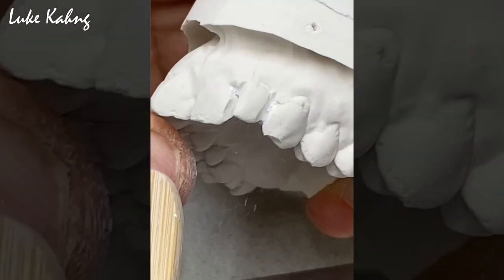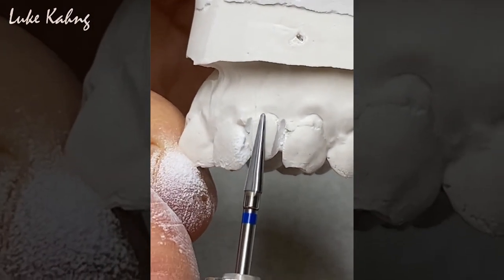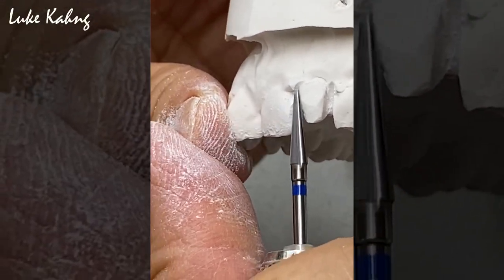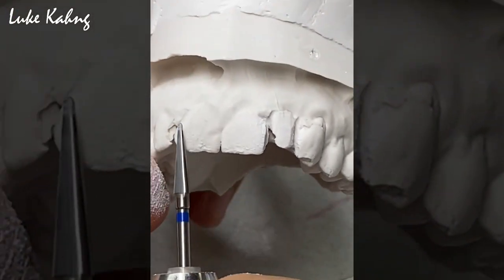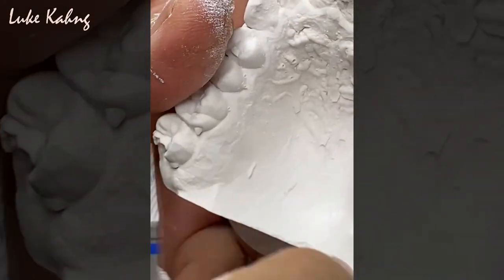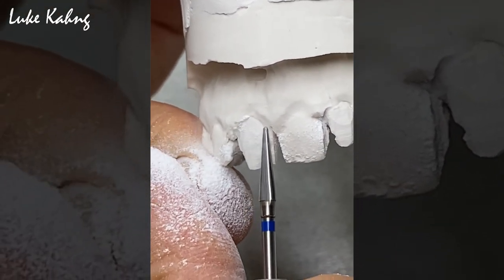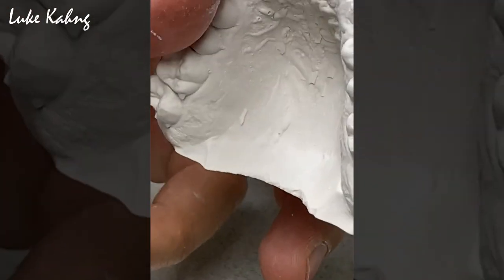Always remember the thickness for final restoration. Eliminate the undercut and decide about crown or veneer. This is definitely crown. Step one. Okay, trying to bring it in as much as possible. Now you can open here. Here is a black triangle, so cut it here.